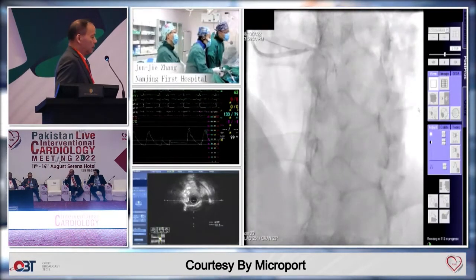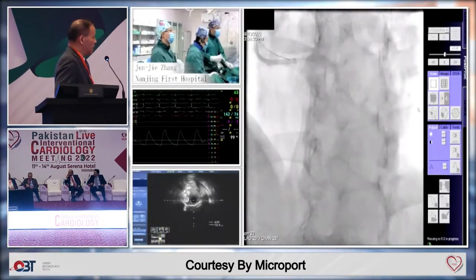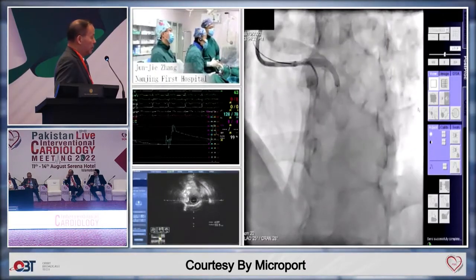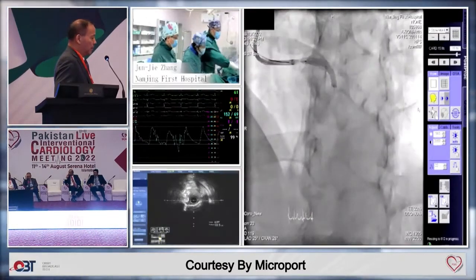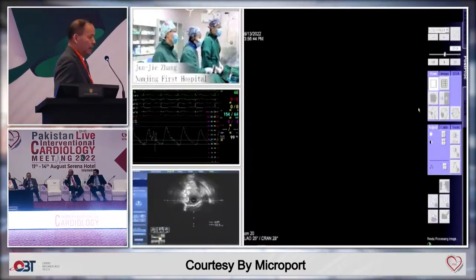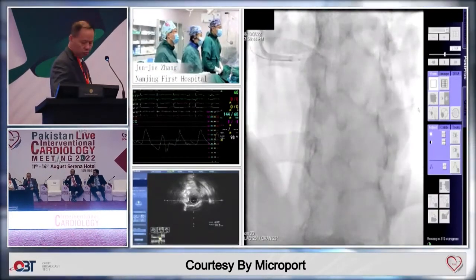Yeah, I think a maximum protrusion limited to 1 millimeter is a requirement. For some junior interventional cardiologists, it will be very tough. But to achieve a maximum 1 millimeter protrusion, we need multiple injections, particularly in the AP cranial view, the best view.